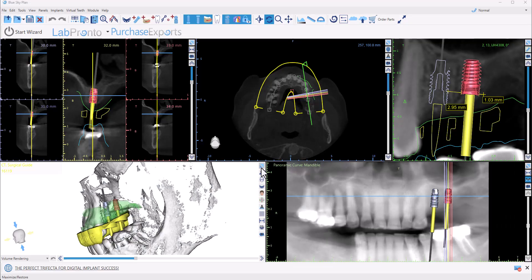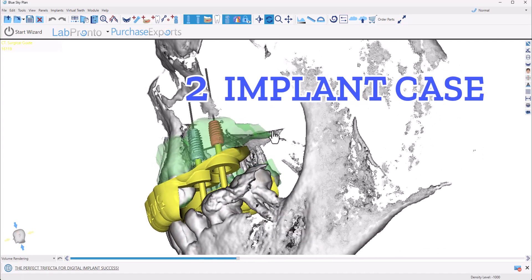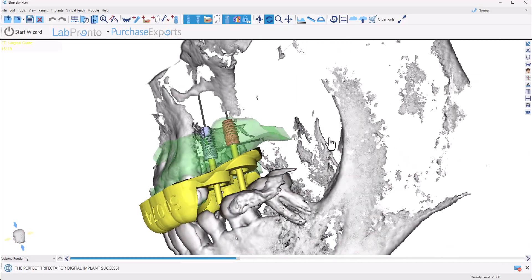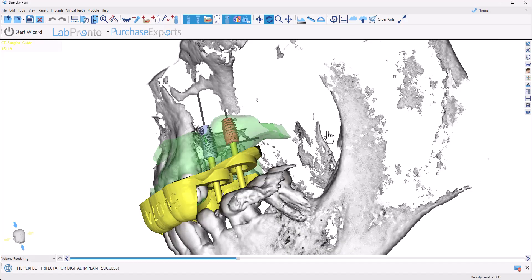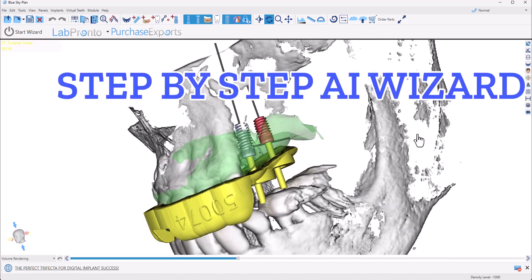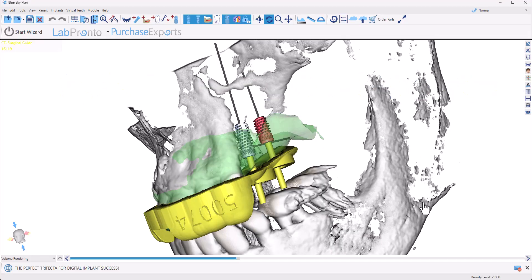Welcome to today's tutorial. I'm going to demonstrate the easiest way to plan a two-implant case, and of course we'll be using the Blue Sky Plan software. We'll be using the wizard, a streamlined workflow designed to be almost completely automatic. Your role is to simply review the AI generated proposals, confirm the steps, and of course make any tweaks necessary along the way.